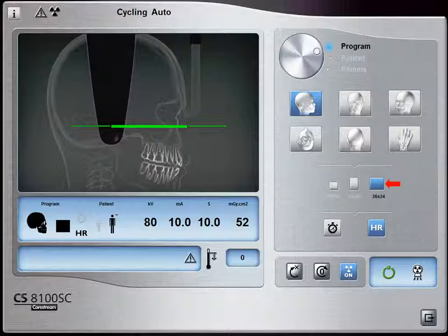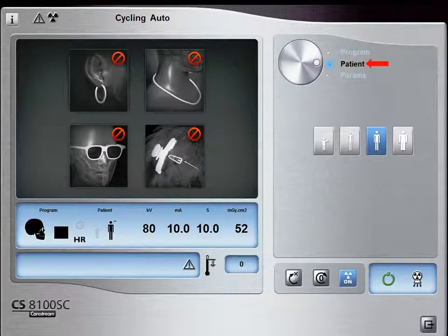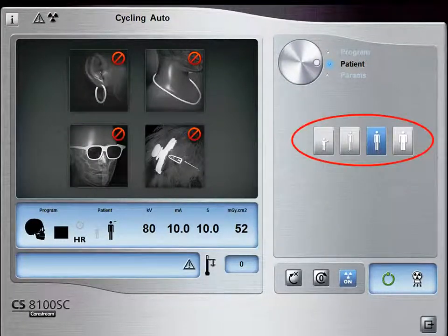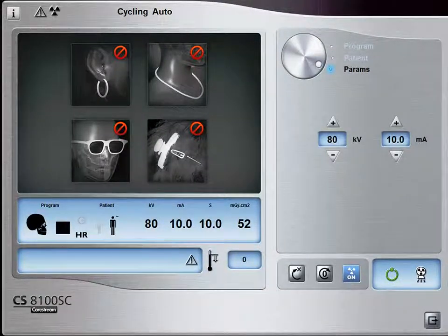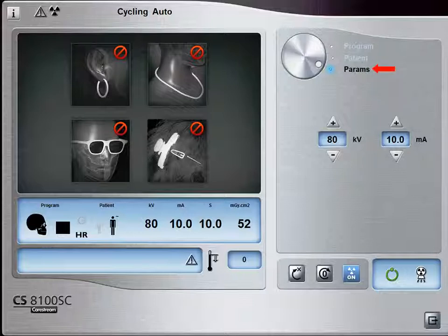Note: the 26x24 field of view does not come with a CS8100SC Access; it can be purchased separately. Select the Patient button to access the patient pane. Select the patient type and size: Child, Small, Medium, or Large. If the default KV, MA, and seconds settings are not correct for your patient type, click the Parameter button and select the appropriate parameters. Select here to fine-tune KV, and select here to fine-tune MA.